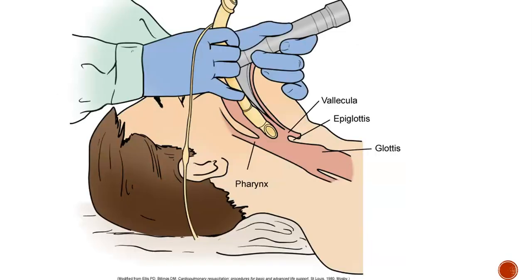So this is basically just a little guide of the intubation process. So we can see our glottis here. This looks like a Mac blade to me. We have a Mac blade and a Miller blade, I'm pretty sure. Mac blades really are the ones that I see used, and they're curved. It just kind of helps with the anatomy a little bit more to have it curved and push things back. Miller blades are straight.